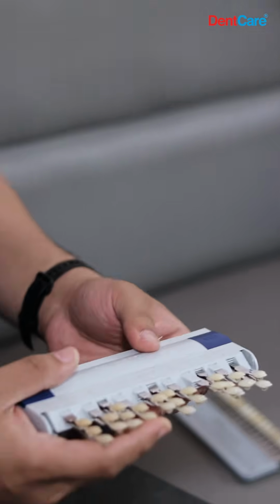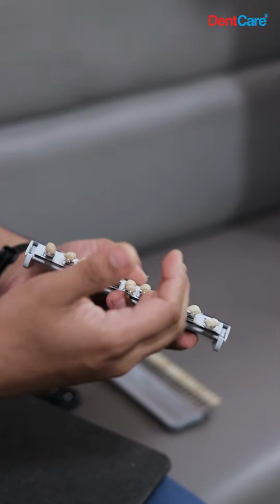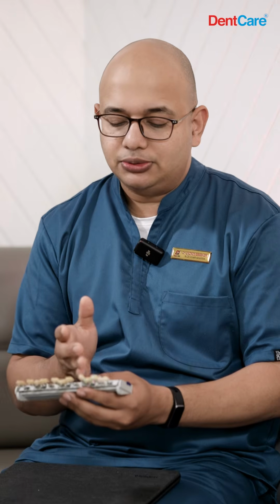How can I use this effectively in my practice? Well, it's very simple. First you select which value range your shade belongs to. You can take the middle of each value, like 2M2 and 3M2, and see which value matches first. You can check values by taking photographs and setting the photo to monochrome, and you can actually see whether the shade matches. Once you select the value, then you go to the chroma and the hue. That's how we do it.